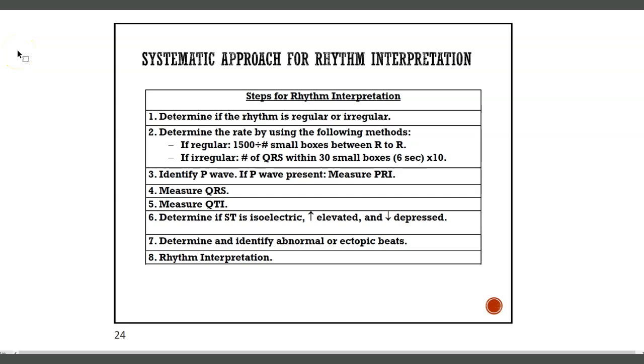Interpreting EKGs can be a little overwhelming and intimidating. That said, while you're learning, it's normal to feel that way. In addition, it just takes time and repetition to really master this skill. And while you're learning, and even when you've learned how to do it, it is very important to follow a systematic approach. So for this specific program, we want you to follow the interpretation step by step. This really makes it a lot easier for you, and it's less confusing rather than not having a method and not knowing where to start. So there are 8 steps that you have to follow.